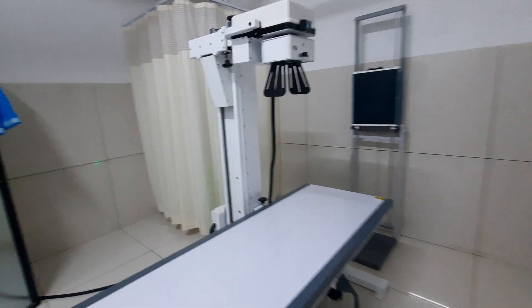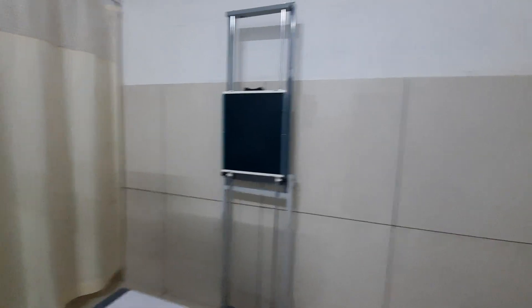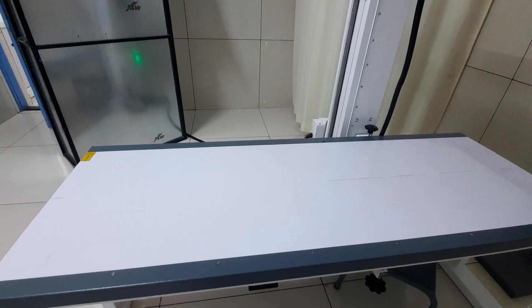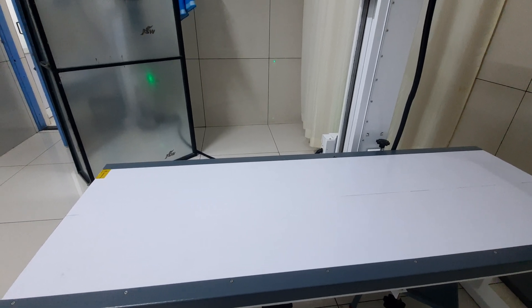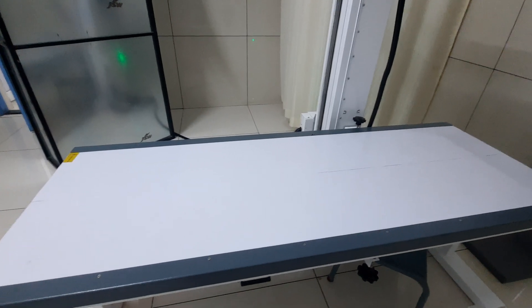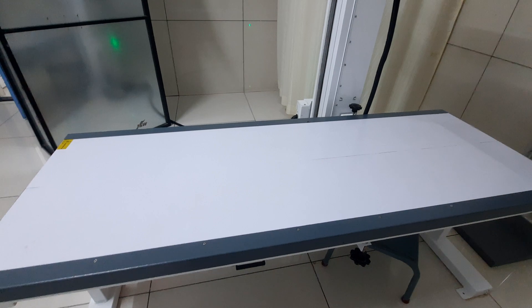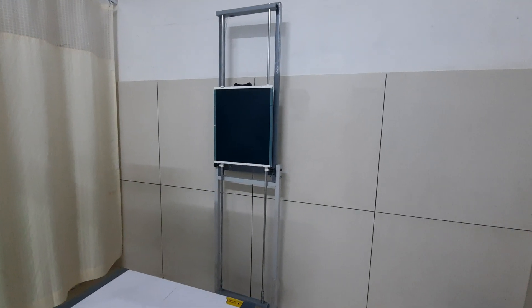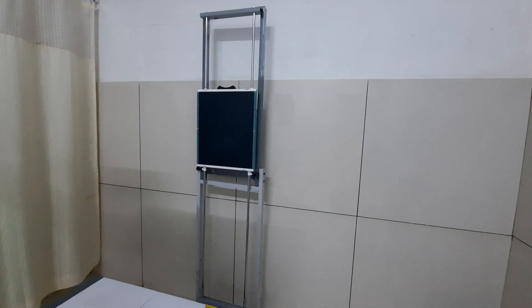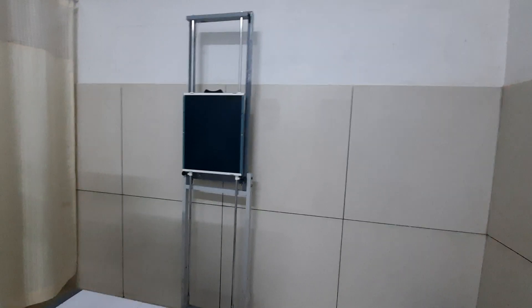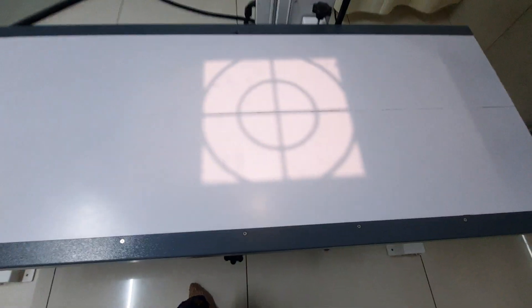This is the x-ray tube, this is the x-ray table, and this is the chest stand. The x-ray table is used for taking x-rays of the lumbar spine, thoracic spine, chest AP views, and abdomen AP supine views — all taken with the patient lying down on the table. X-rays such as chest, shoulder, c-spine, and knee joint standing views are taken using the erect chest stand.